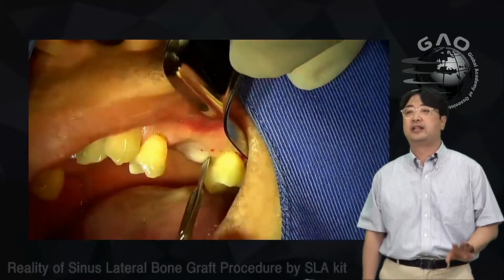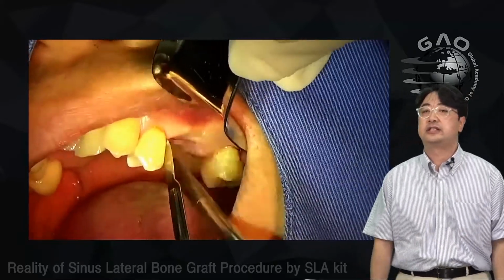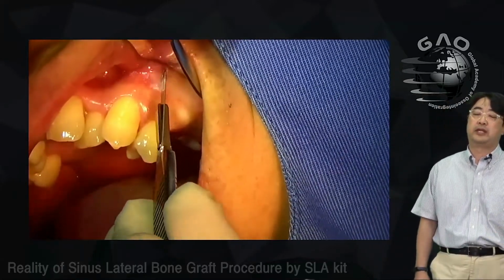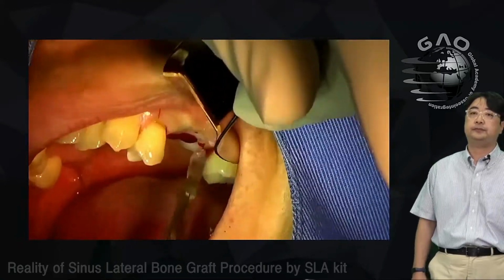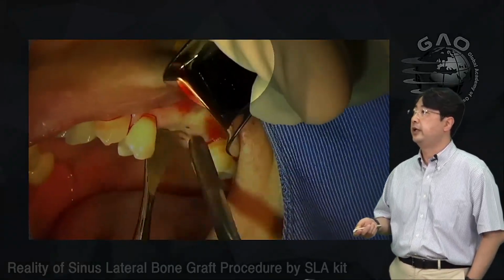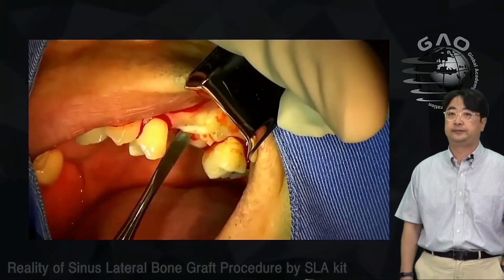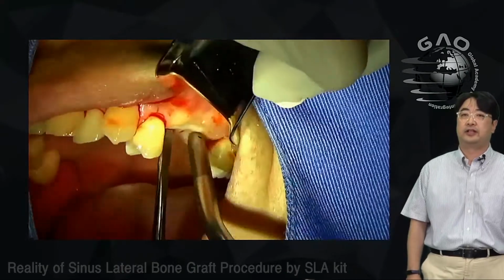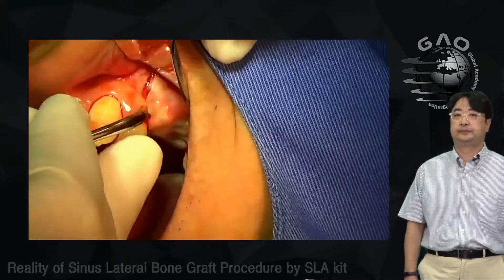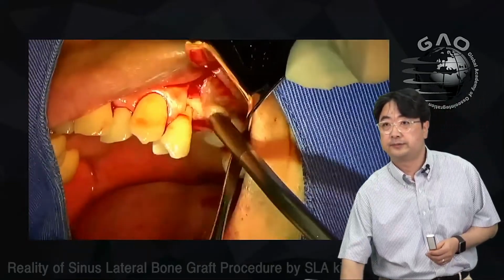So I made it a little faster. I encoded it a little faster. This is the movie clip while I'm making the incision. I made a crestal incision here, and I made one vertical incision on the front tooth, number 24. I'm going to move a little faster.